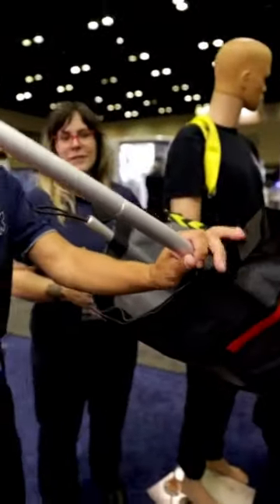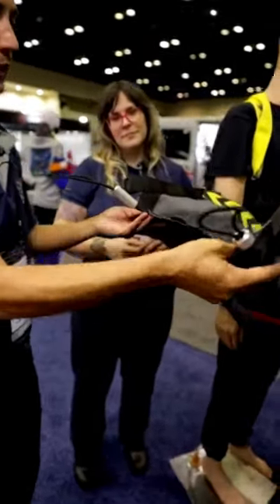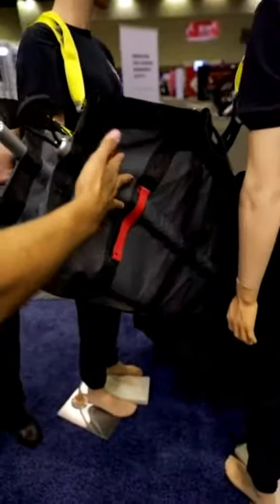There are also poles that come with it — two poles. They slide into these little pockets, and the point of them is to keep the device rigid so it doesn't squish your patient when you pick them up. It gives some rigidity to the device.